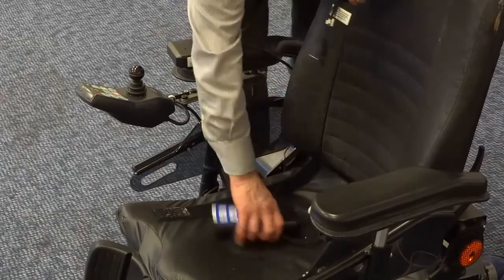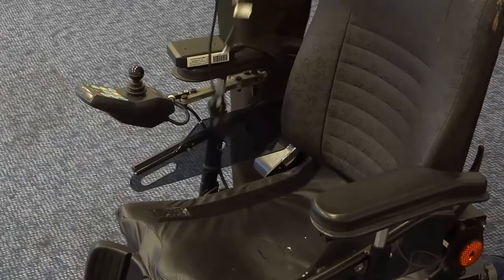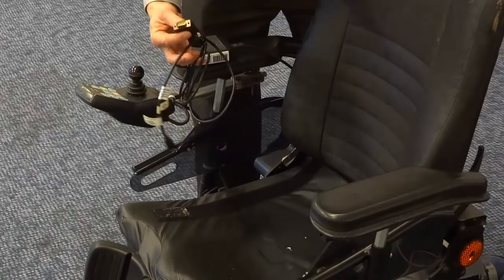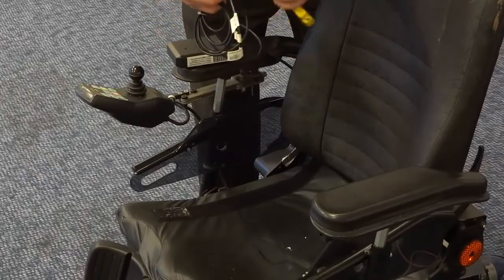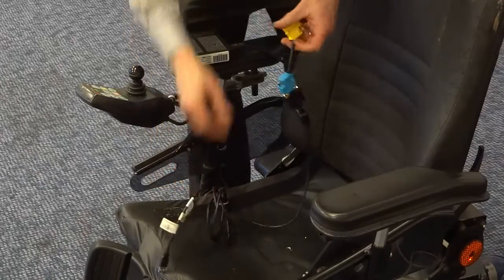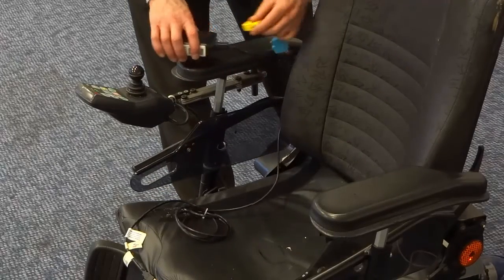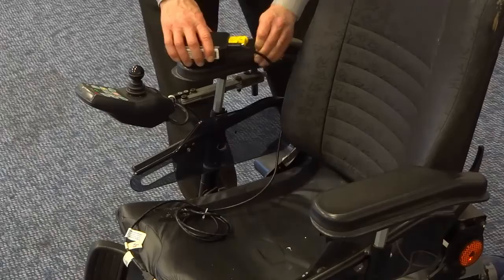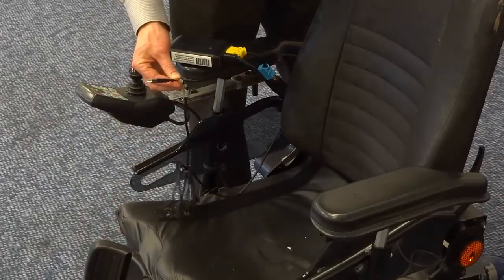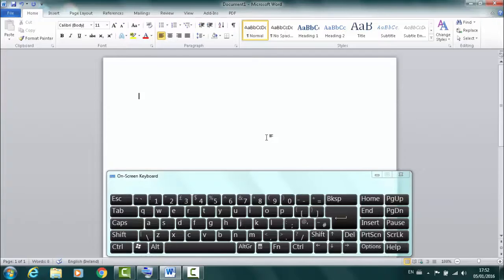Another possibility is to connect to devices that are joystick controlled, such as a mouse mover. The D9 USB mouse interface from Unique Perspectives is a mouse mover that can be easily used. The USB end connects into a computer and allows the wheelchair joystick to control the mouse cursor on the screen.